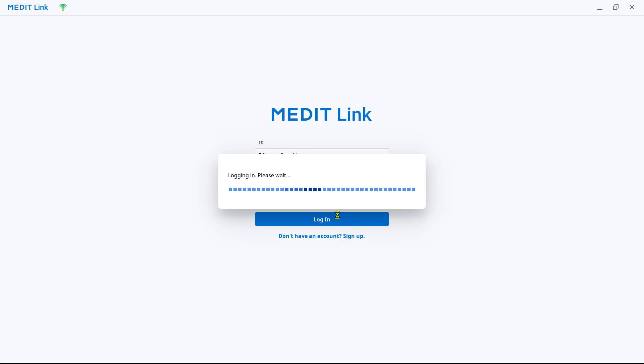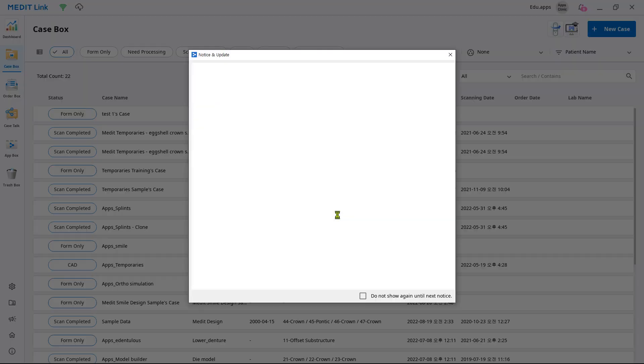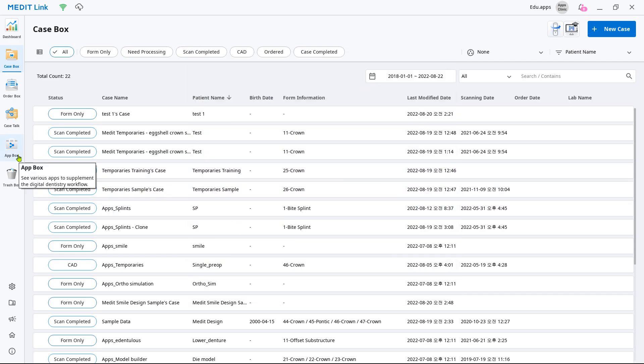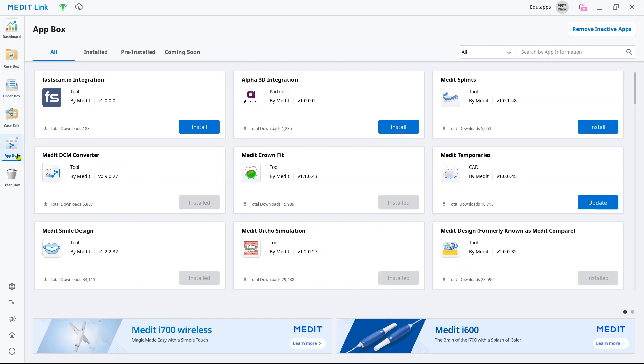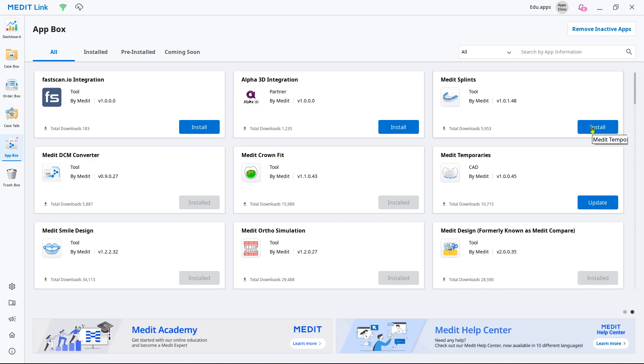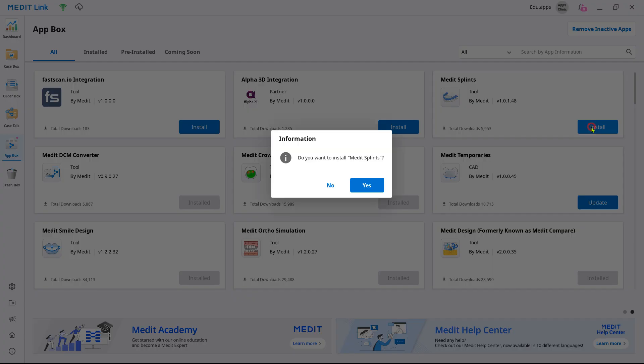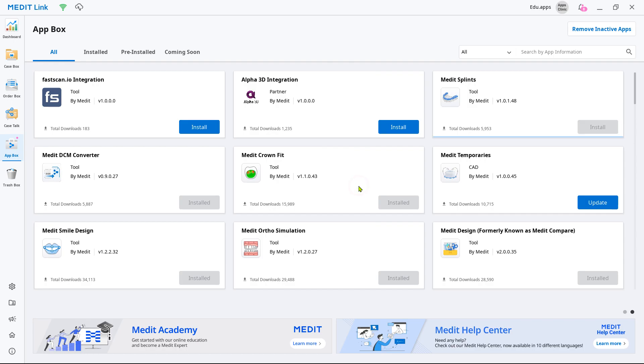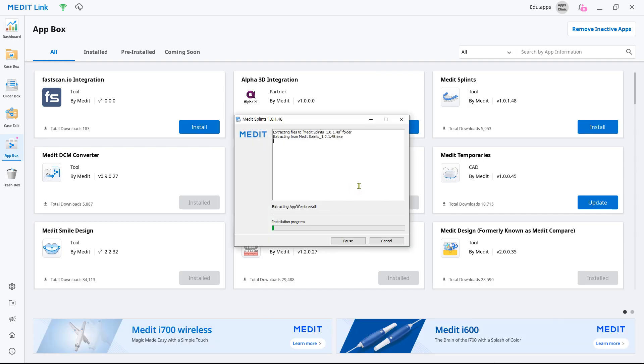Log in to your Medit link and go to the app box. Then find the Medit splints app and click install. The installation file will run automatically once the app is downloaded.